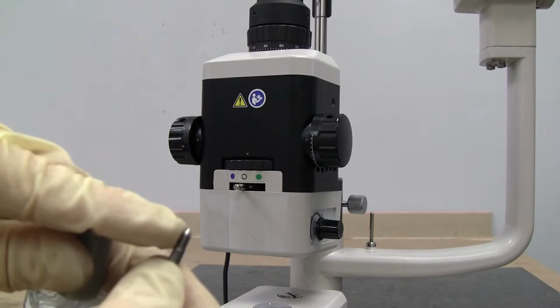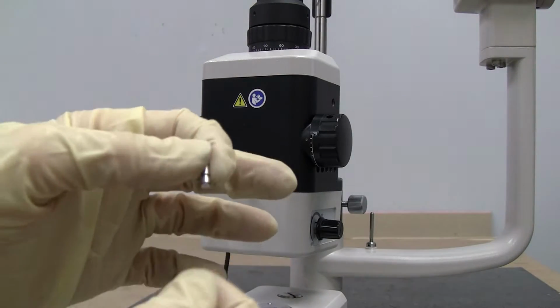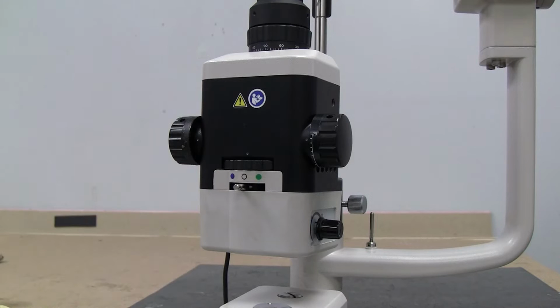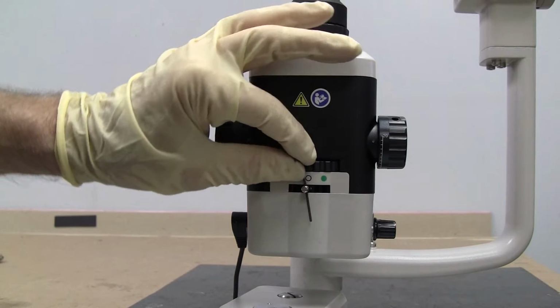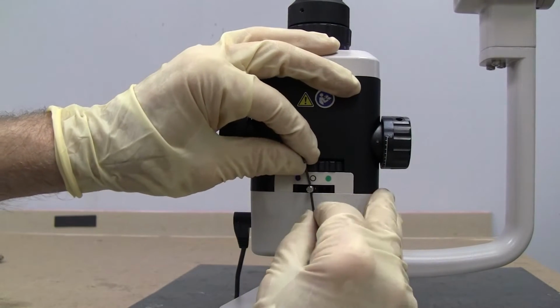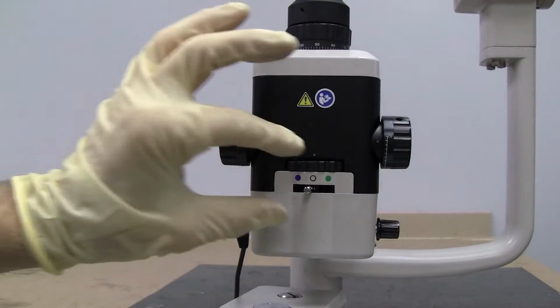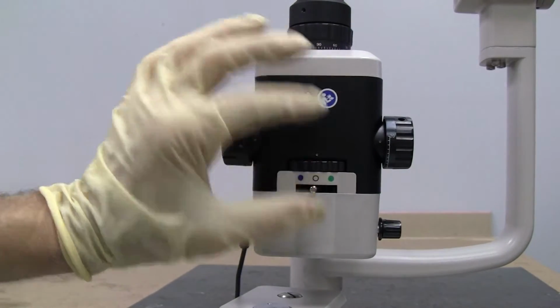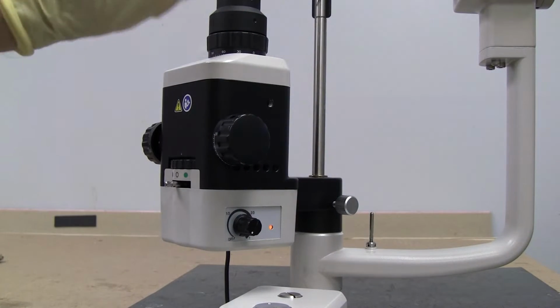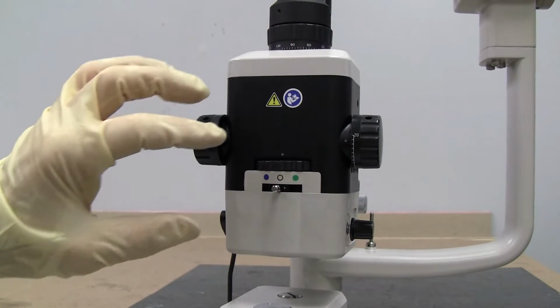I'm going to use a little bit of polish, just a dab on the threads, so that when we tighten it, after we've aligned it, it might stay a little longer. So I'm going to loosen this one. Now try to get it in the center where it's clear, so that when you put it back in, you'll have a good reference point.